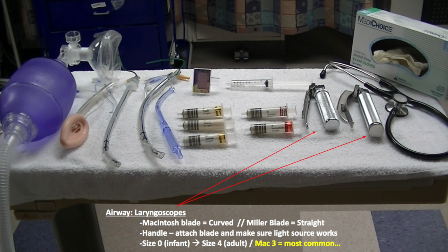The Macintosh blade is used to manipulate the vallecula, which subsequently mobilizes the epiglottis and allows visualization of the vocal cords. The Miller blade is used to directly manipulate and lift the epiglottis out of the way so that you can access the vocal cords. The Macintosh blade is the most commonly used laryngoscope blade.